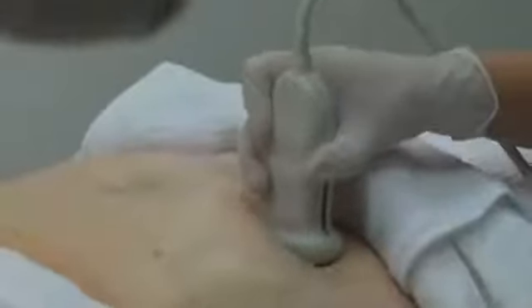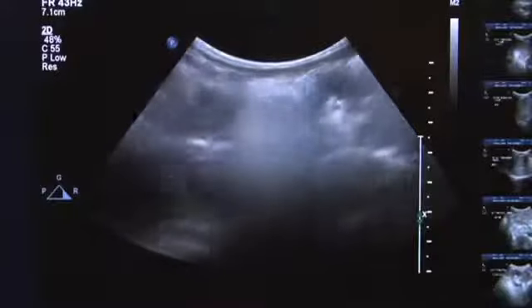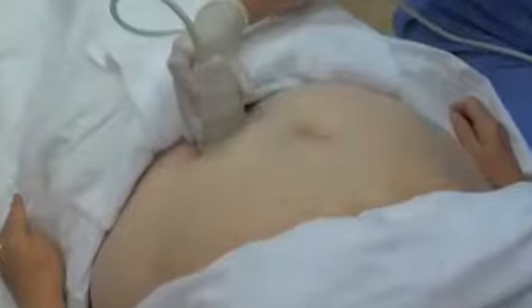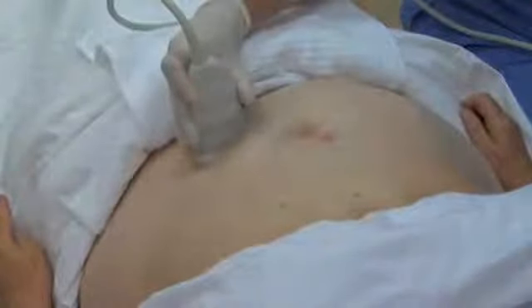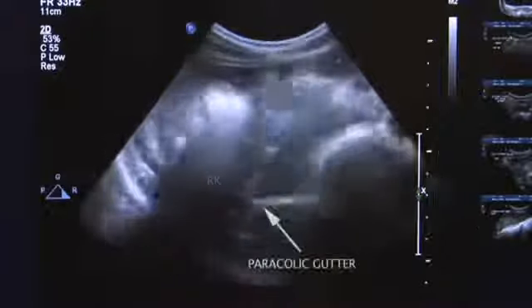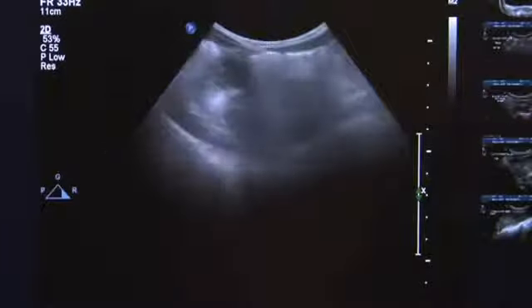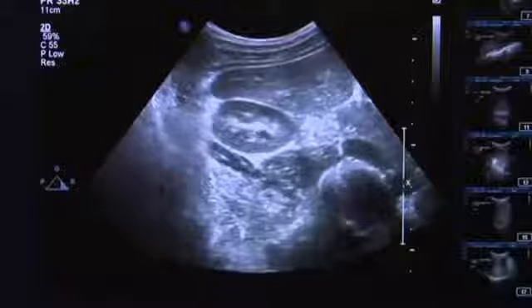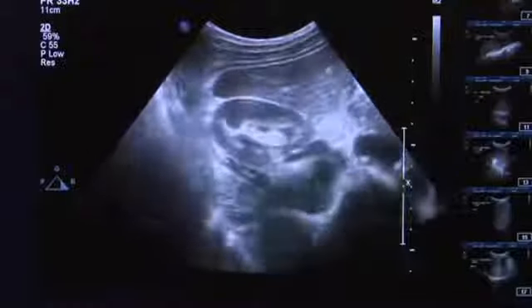Scan the right lower quadrant to evaluate for ascites, masses, or appendicitis. The left lower quadrant is also scanned for ascites and masses. With the patient lying supine, any free fluid tends to accumulate in the pericolic gutters and pelvis. Scans of the right and left lower quadrants should be made in 2 planes, longitudinal and transverse. The amount of any fluid should be measured and documented.